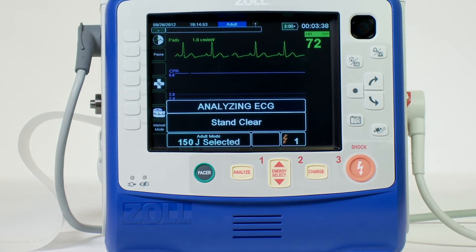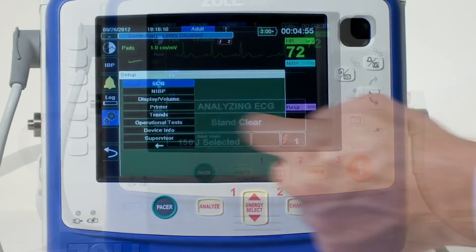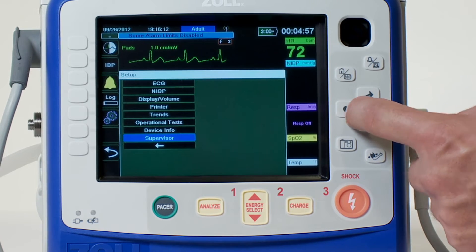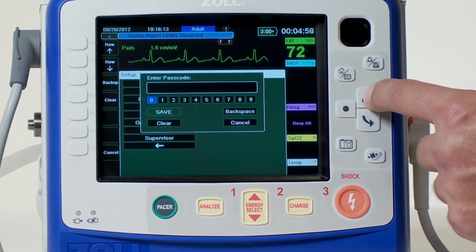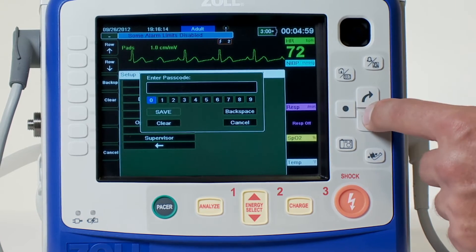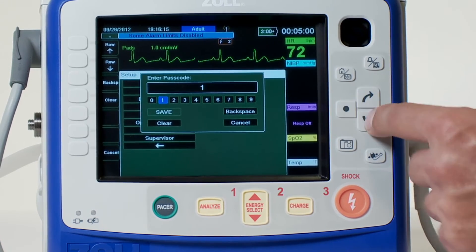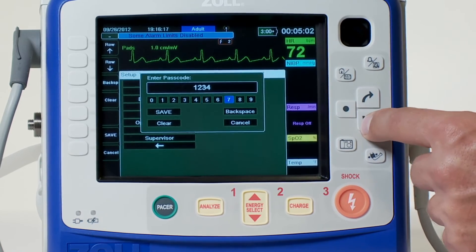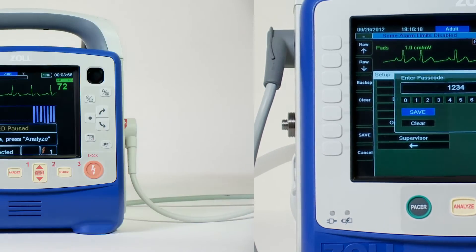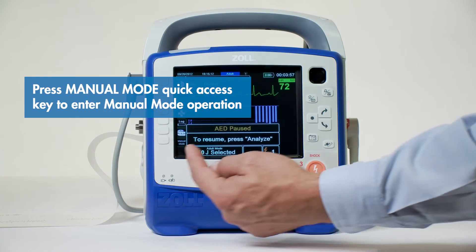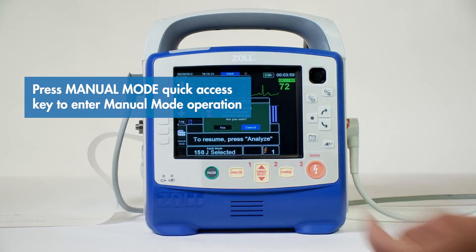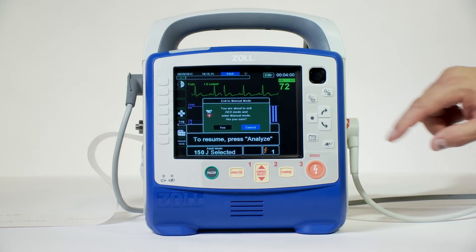If an advanced life support rescuer is present, he or she can manually override the AED mode using a two-step process or four-digit password. Press the manual mode quick access key on the front panel of the unit to enter the manual mode of operation.